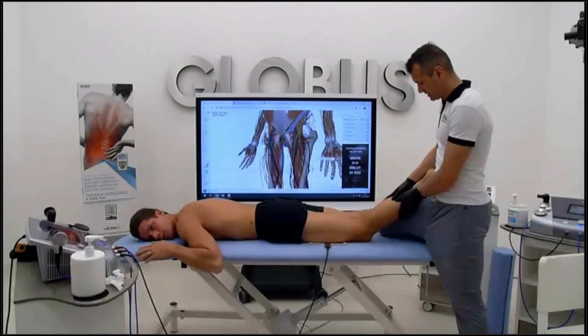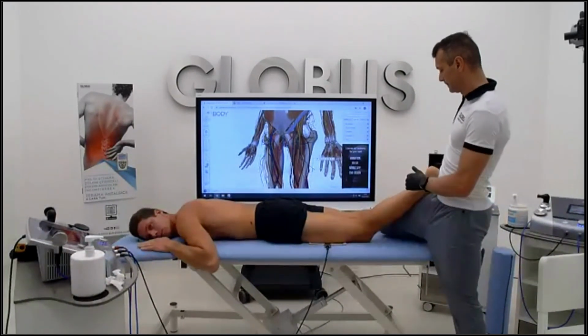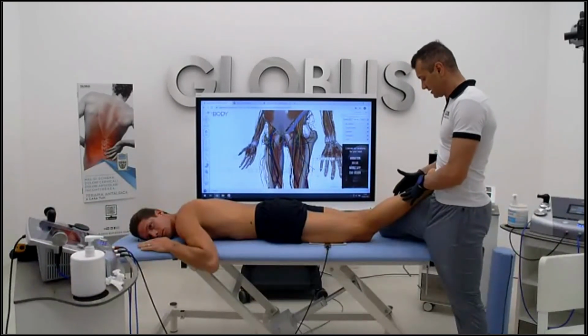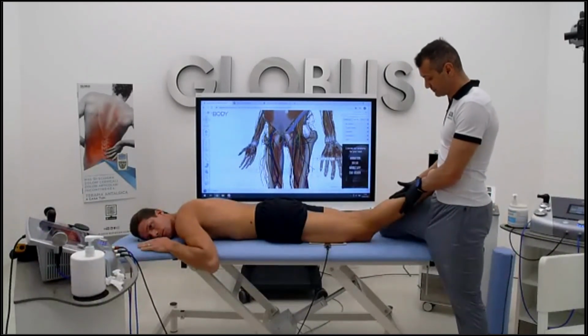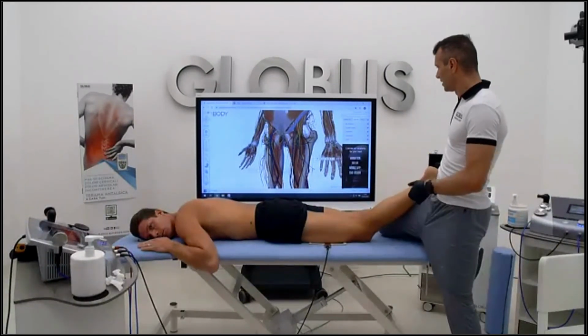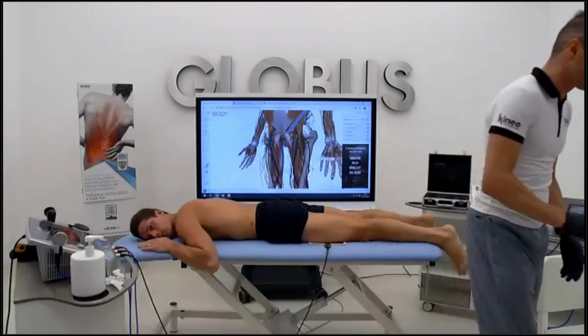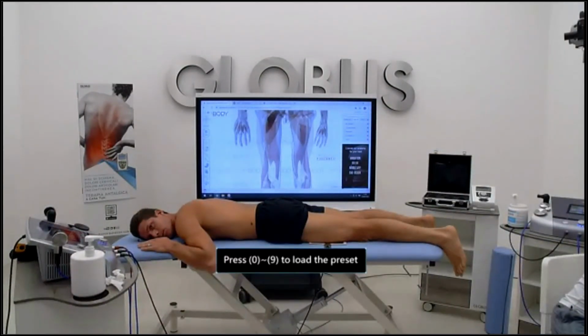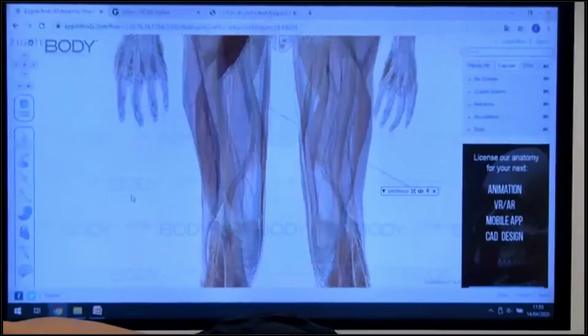As you know, the gastrocnemius junction is one of the most typical sites of lesion and of densification. Maybe I can show you just in one second what we are talking about, because the anatomy always helps us understand.